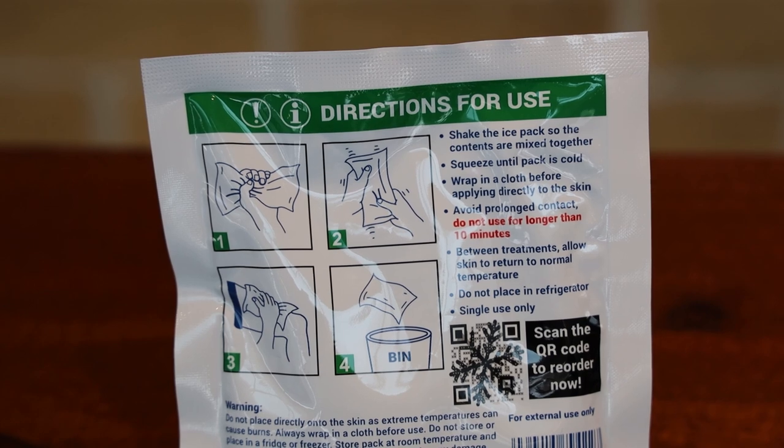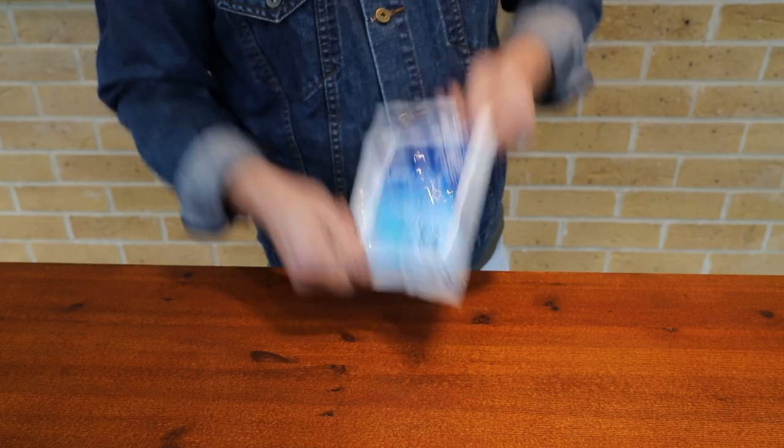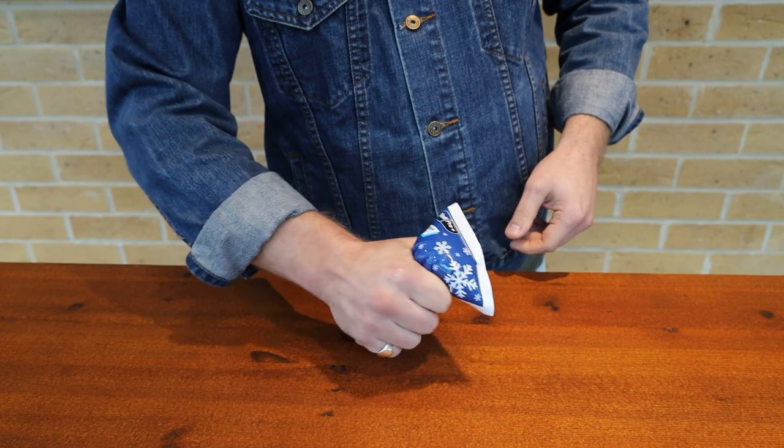Before you start, make sure you read the instructions on the reverse. Pick up the ice pack, shake it so the contents are mixed together and then squeeze until the pack is cold.